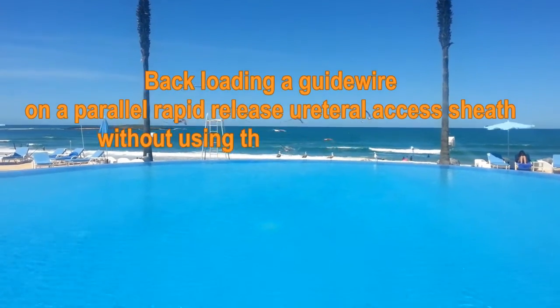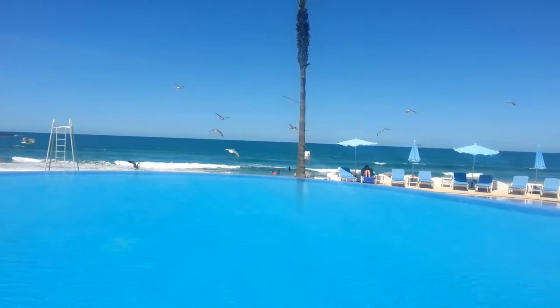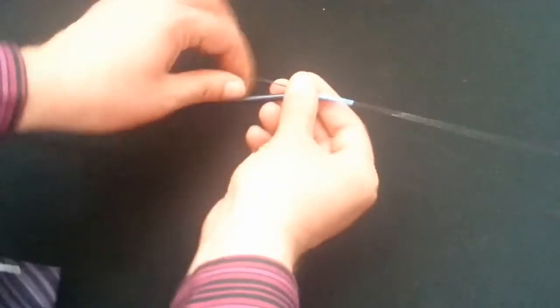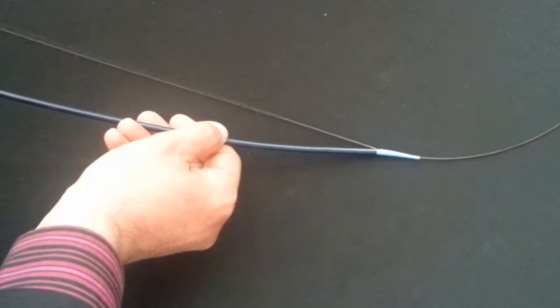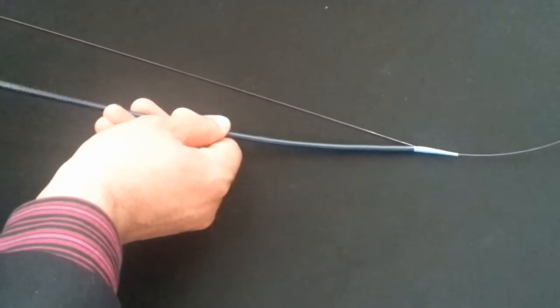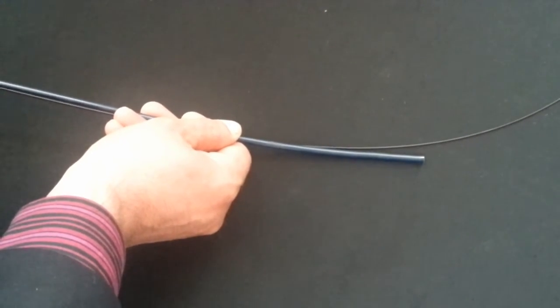The parallel rapid-release ureteral access sheath is a good way to transform the working wire to a safety guide wire. The guide wire is passed in a split of the first three or four centimeters of the dilator. When the dilator is retrieved, the guide wire is outside the sheath.